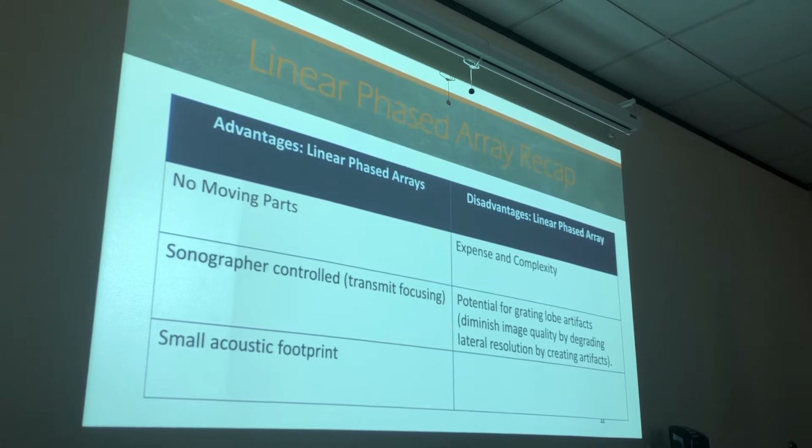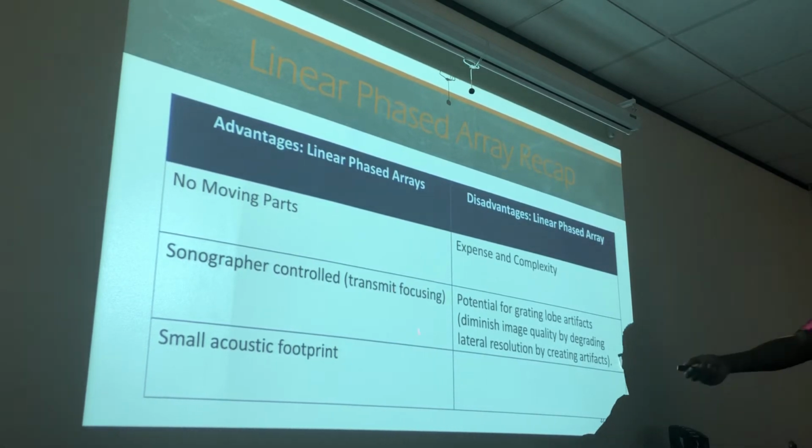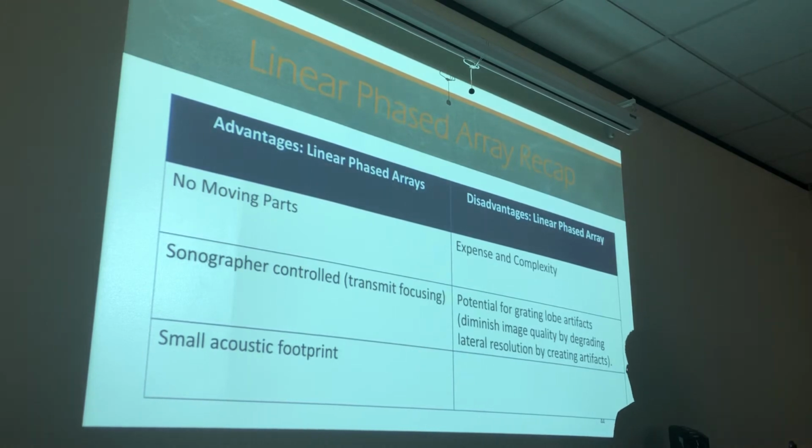Some advantages of linear phased array, guys: it's electronic, no moving parts. It's not like a mechanical transducer or an annular array transducer. It is also sonographer controlled. The transmit focusing is. Remember, we don't control what, guys? The dynamic receive focusing. We control the transmit focusing, but we don't control the dynamic receive focusing, or just dynamic focusing. You might see it both ways. That's already established upon reception by the ultrasound system itself. And it has a small acoustic footprint.